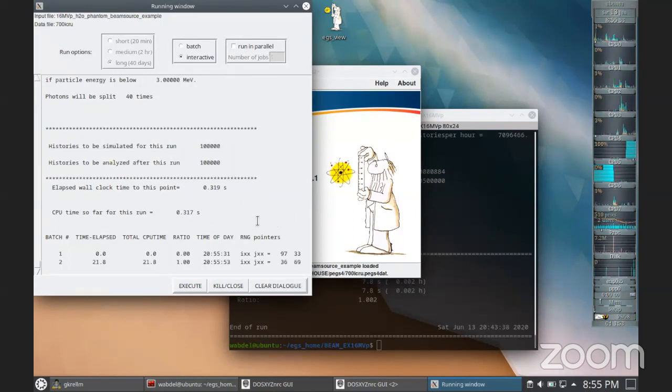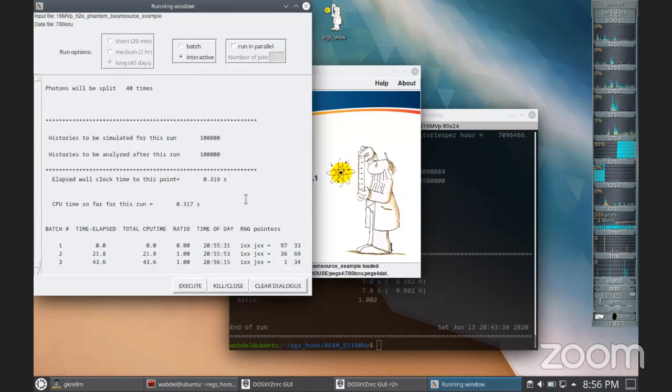So definitely, this is going to take a bit more time, because it took us some time to actually do the simulation for the beam. So if you want to do a comparison, there is a beam simulation, and then there is a dosxyz simulation. But the nice thing about this is it does not need to redistribute the particles. So that's a nice feature about having a source, a linear source.